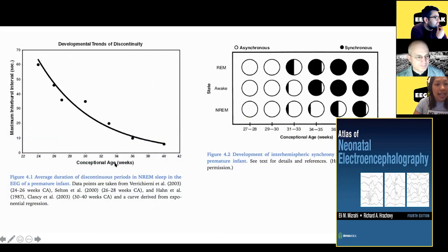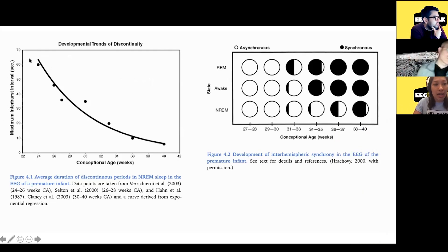So here on the x-axis, we have the conceptual age of the baby. And on the y-axis, we have what would be a reasonable interburst interval in seconds. So if you look at this, a 24-week, or if you were to do an EEG on them, could have an interburst interval of 60 seconds. Whereas a baby closer to the age of the baby we're looking at right now can have an interburst interval of around 10 seconds.